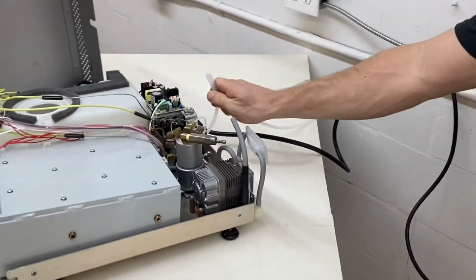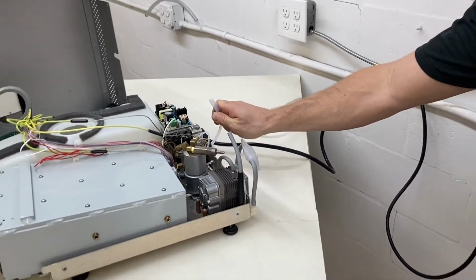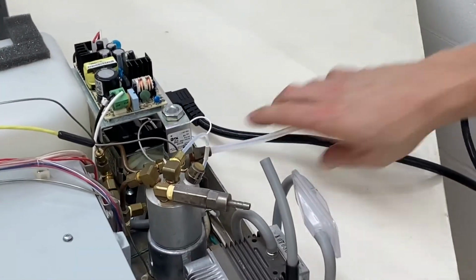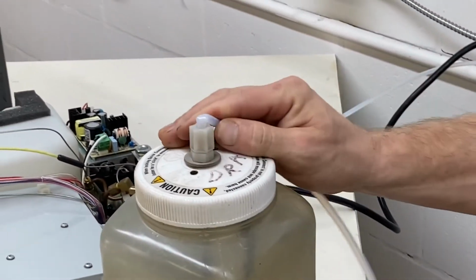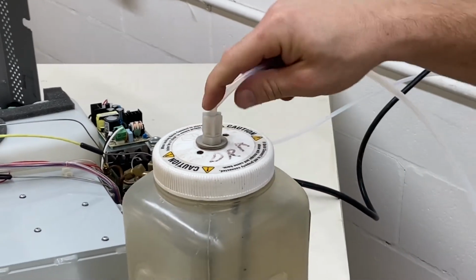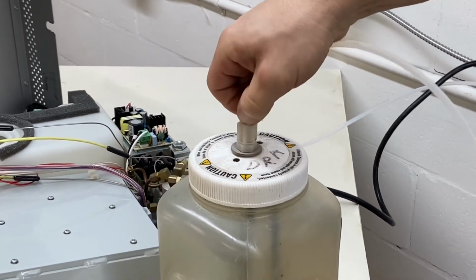See that? That's bad. Kinked, pinched. We don't like that. That happens here. That happens at the fitting a lot. It also happens at the top of the bottle a lot. Sometimes you'll see a kink there. That's also bad. So we're going to check for a leak. We're going to check for kinked or pinched exhaust tubing.